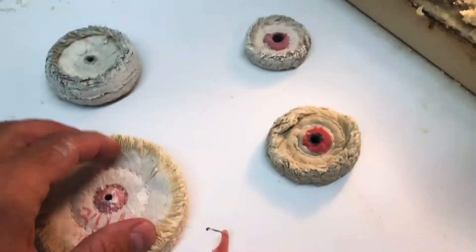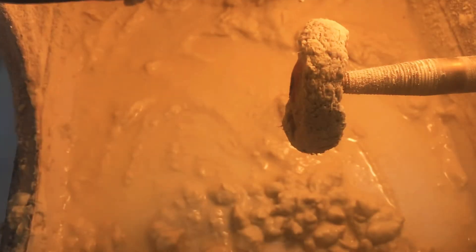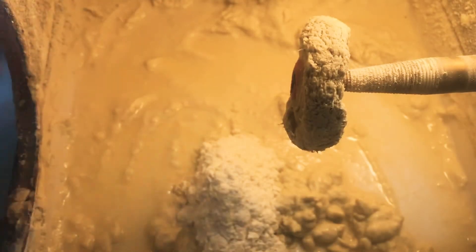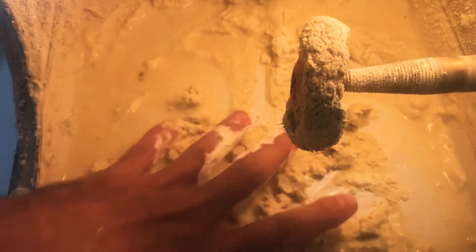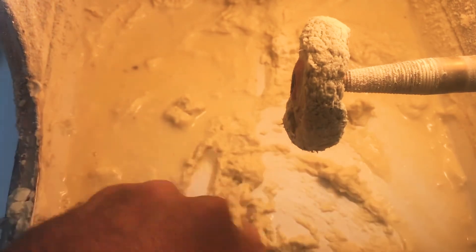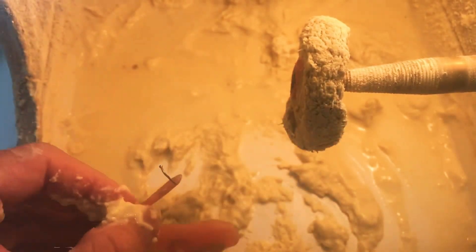Alright you guys, we're going to move over to the polishing wheel. Obviously there are multiple size wheels, but we're going to use this medium size wheel. I'm using a pumice material that has some grit to it so that it helps us to knock down the rough spots on the partial. And I'm wetting the wheel because you don't want a dry wheel — it will burn the acrylic and the teeth on the partial.